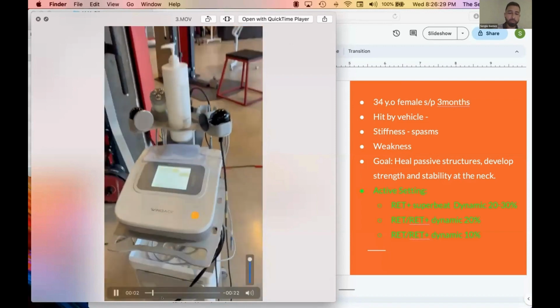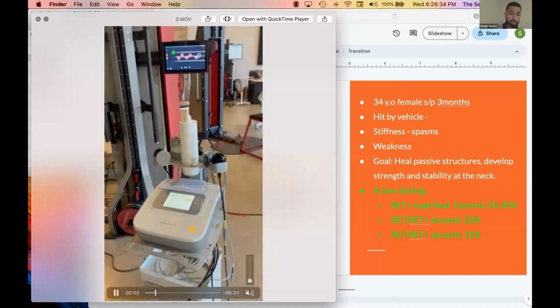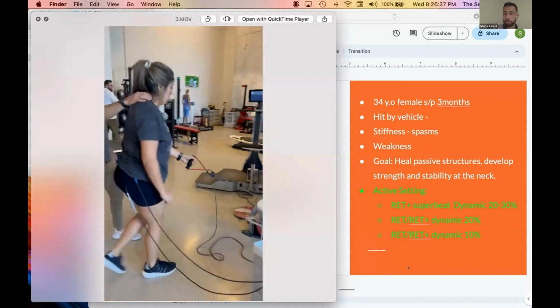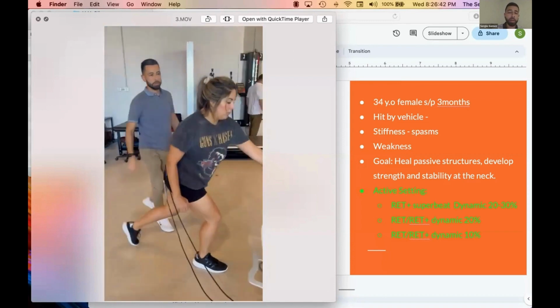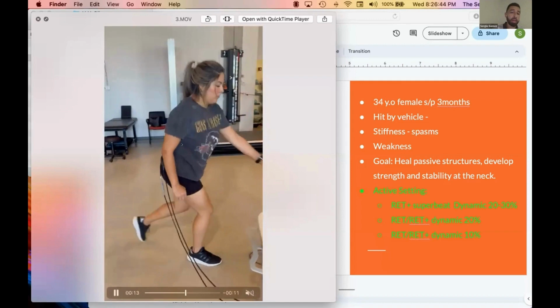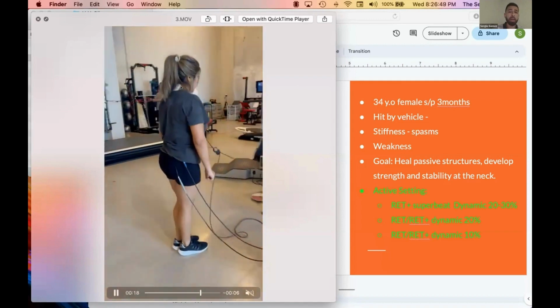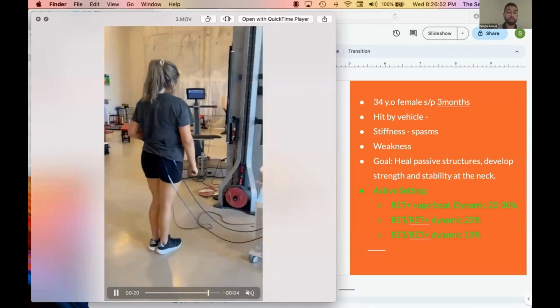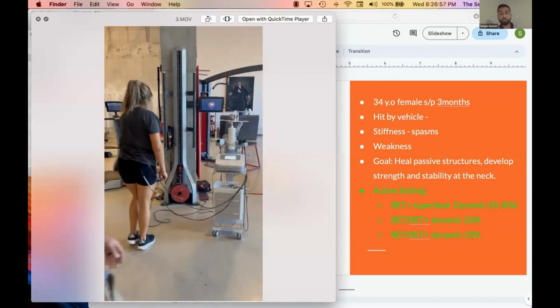Again, low level heat here. The idea is I have it at 10%. I also wrote down here on this side what I have. And while I'm having her do an active contraction, trying to regain thoracic mobility, trying to encourage cervical stability, and again getting the current running, same sticky pad location as what we had on the table, but now moving it in an active way, and keeping the low level current. Again, she could feel some of the warmth, and I'm okay with that. I'm okay with a little warmth.